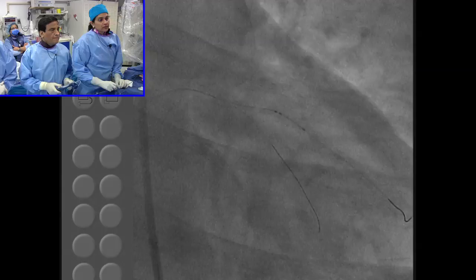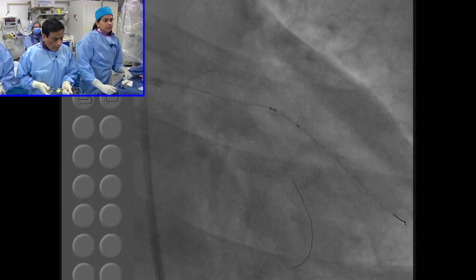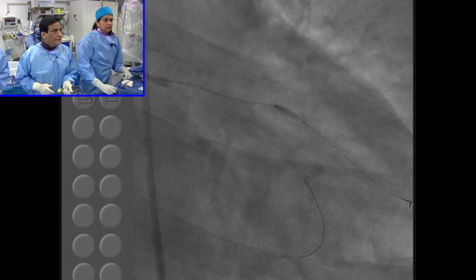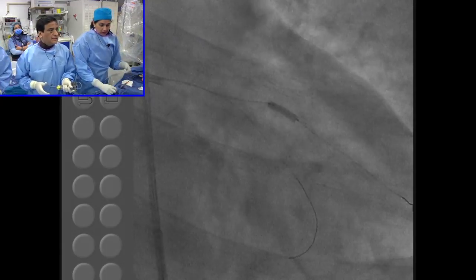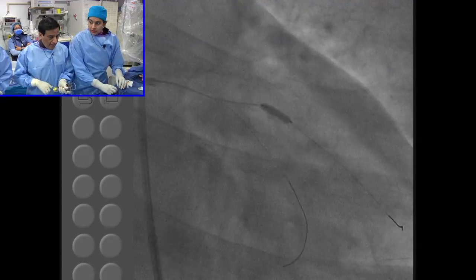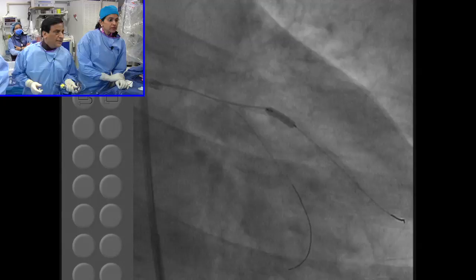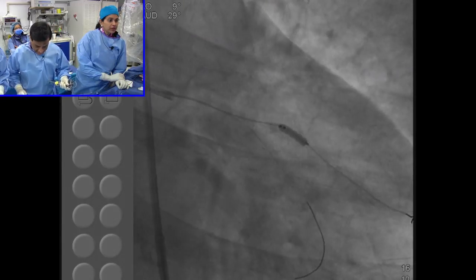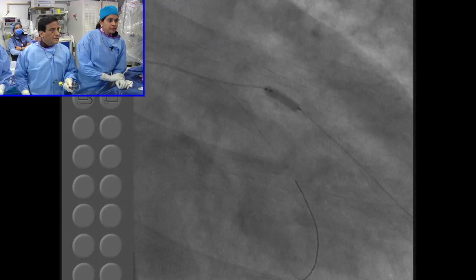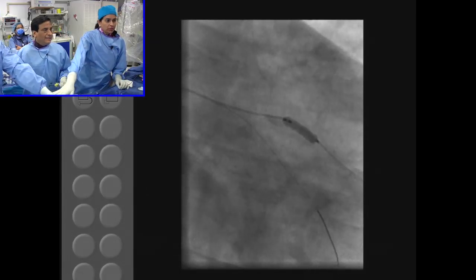Dilate here. Go. Okay, easy to track. Yeah, we are actually just gaining ourselves some experience. This is a 2.5, 10 millimeter, and maximum you can go up to 16. See that little corrugation? Maybe I'll just see it one second. Let's see those chocolate bars. Right. Hershey bars, you see it down.